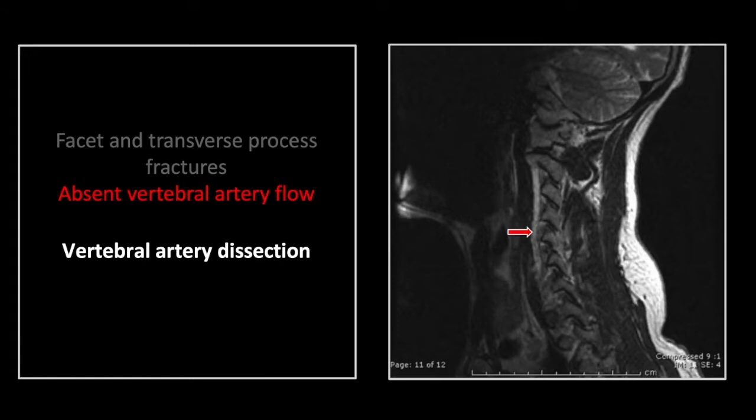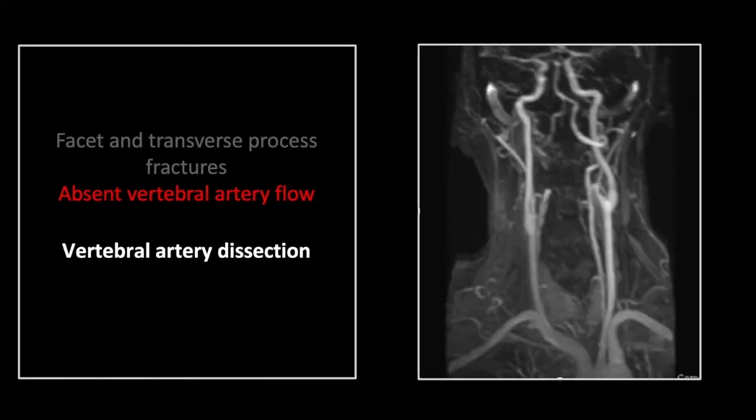Since encountering this case early in my career, I have sought that artery on every sagittal image, and it has often borne fruit. On the 3D reconstruction, you can see the right vertebral artery is simply absent throughout its length.